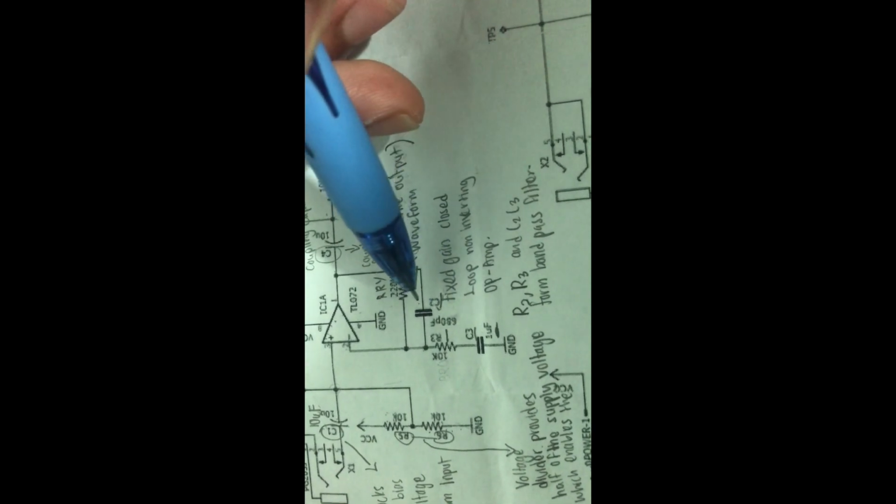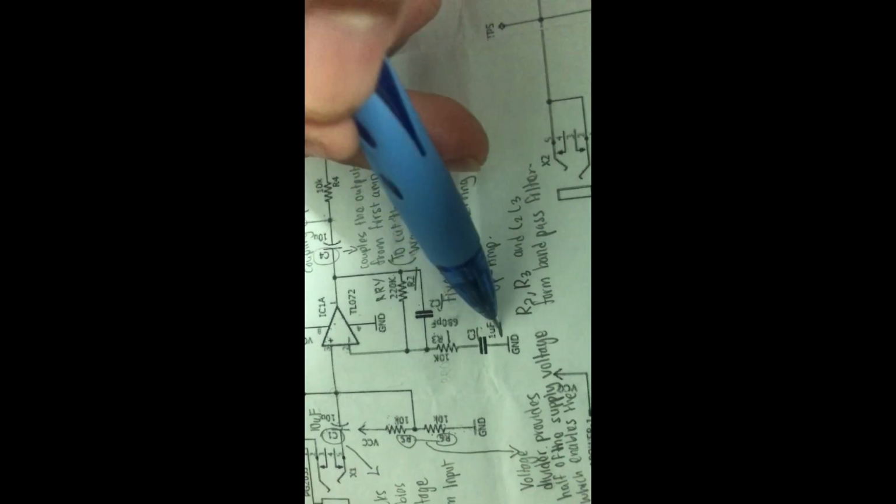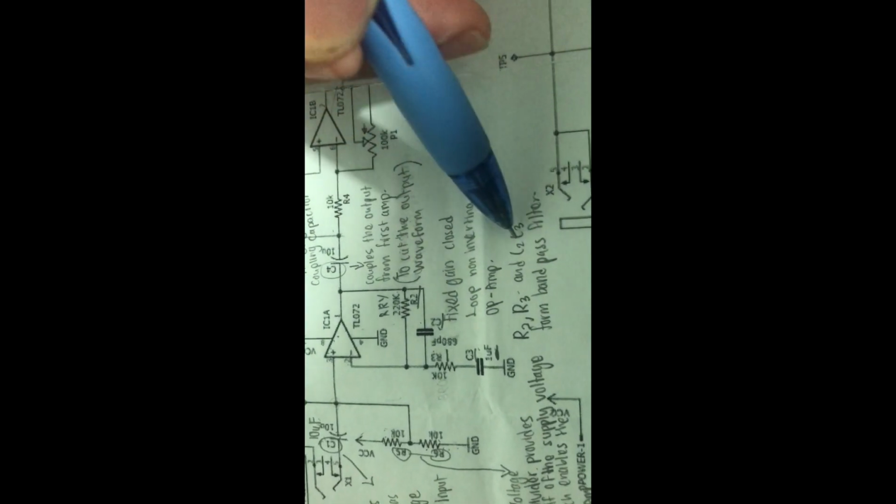At this part of the circuit, we have a 220k resistor, a 680 picofarad capacitor and a 10k resistor, and we have C3, another capacitor of 1 microfarad. So this is a fixed gain closed loop non-inverting op-amp for this part only. Okay, so R2, R3, C2 and C3 form a band pass filter.